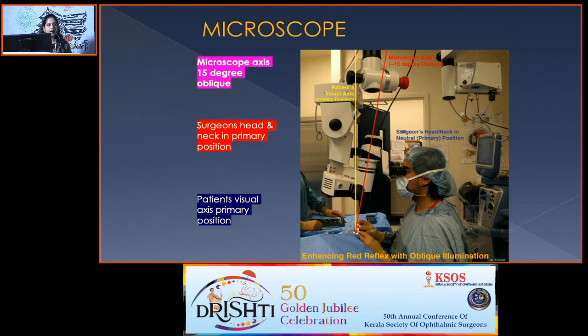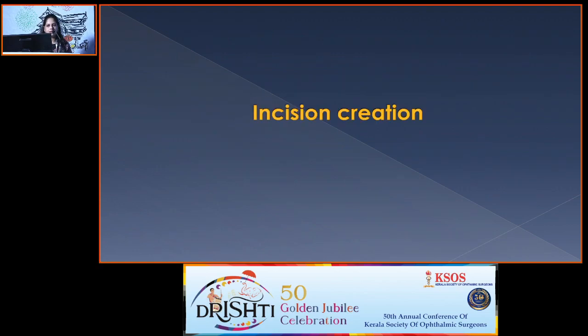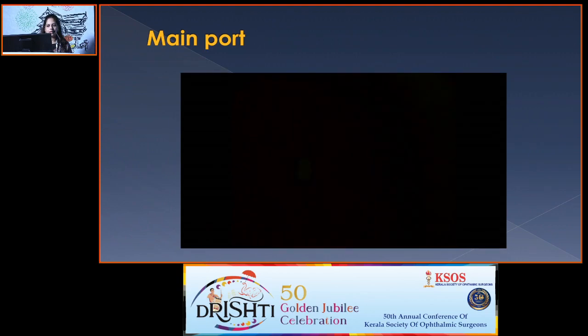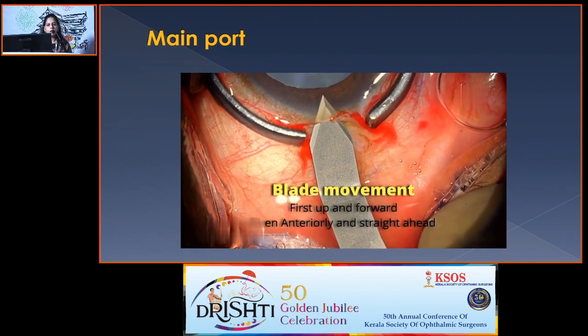Also, drape the lashes properly. Never keep the speculum too much widened, as it can result in difficult instrumentation and increased posterior pressure. In the initial cases, select a peribulbar or subtenon, whichever the surgeon is comfortable, and later can update to intracameral and topical anesthesia.